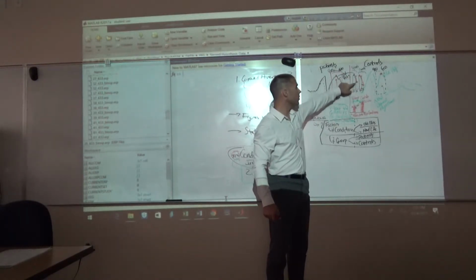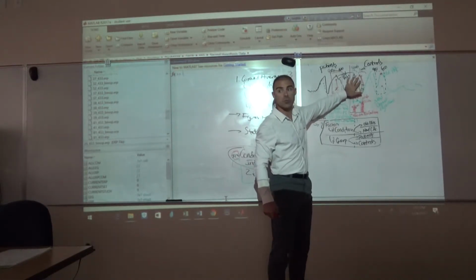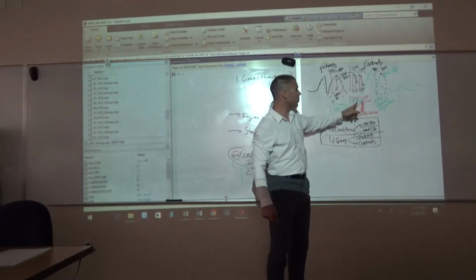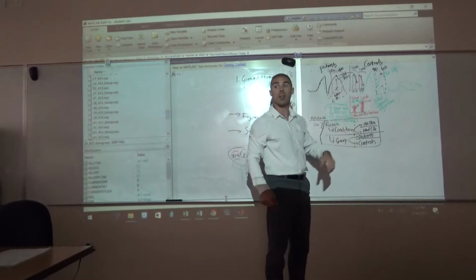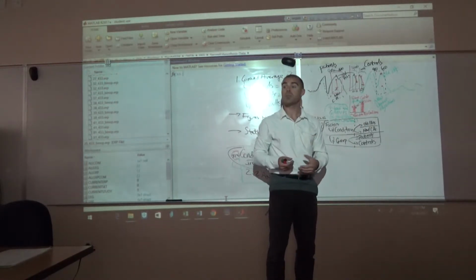So instead of doing a t-test here and a t-test here, you would just drop these 4 parameters into a 2x2 ANOVA, it's the same thing. Okay? You subtract those conditions for each group and you get a value. And those groups are going to have different values, and we can run a between group t-test in order to identify if the groups are different in their difference waves for the memory conditions.